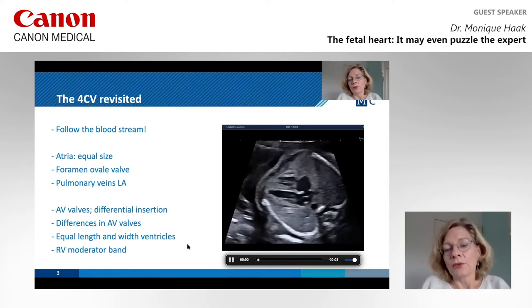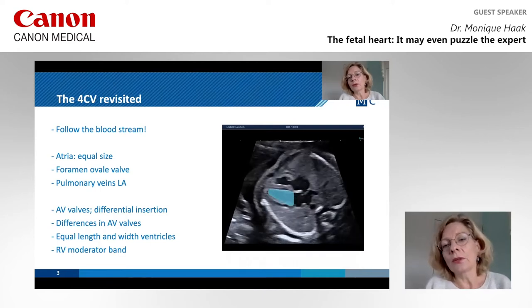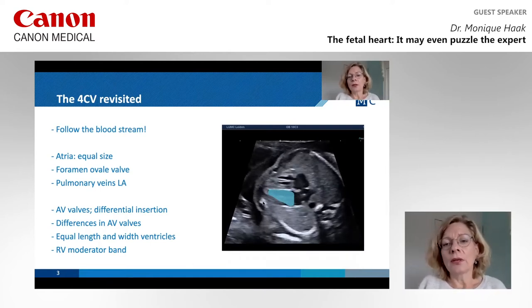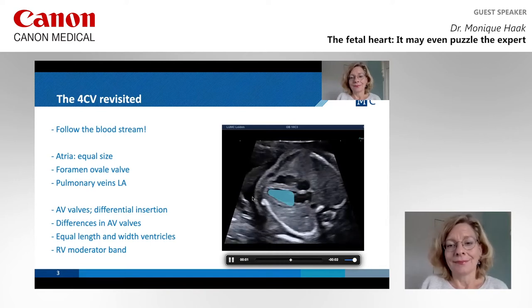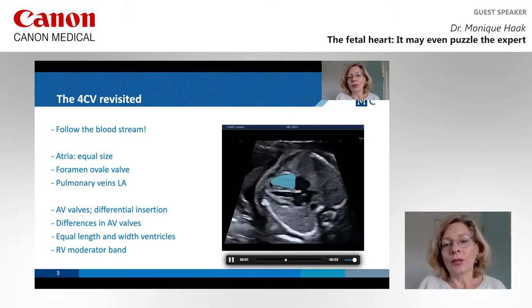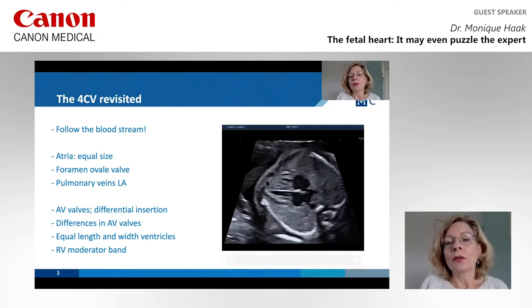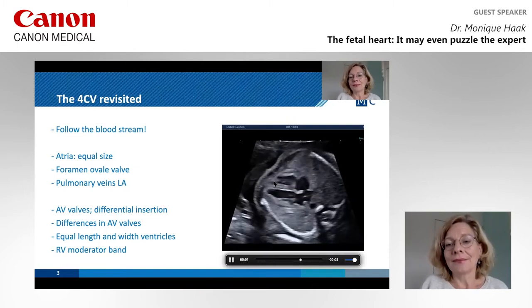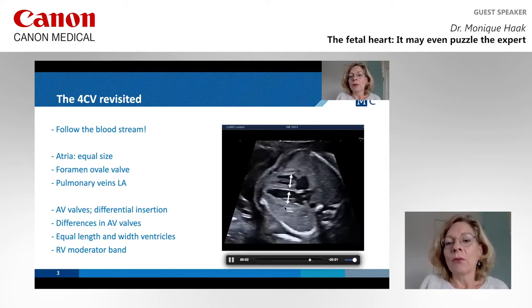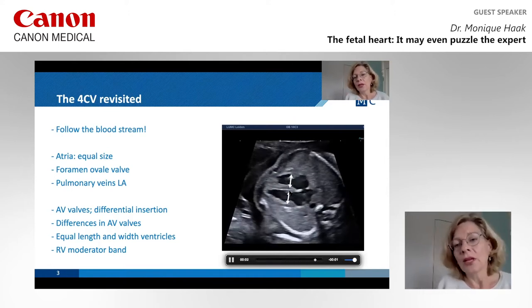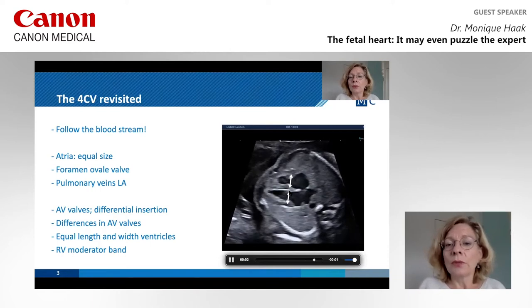Then we go to the ventricles. The left ventricle is more or less triangular shaped, especially the lower part which forms the apex. The right ventricle is a little bit more globally shaped and contains the moderator band. To assess whether these ventricles have equal length, look just below the AV valves — the width of the ventricles should be similar, and that is very important.